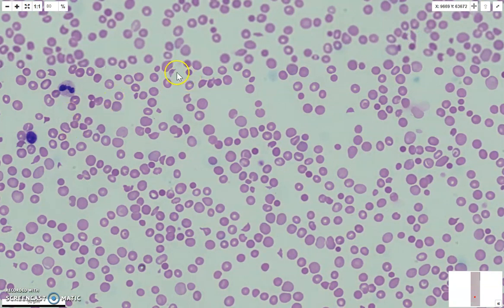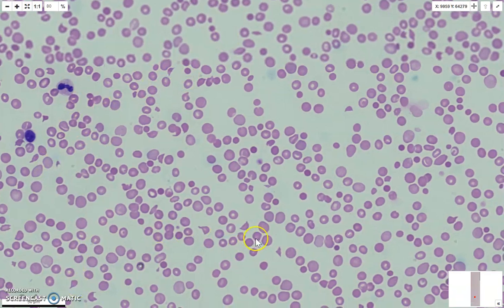Sorry for my resolution on my computer. Hopefully this will work for you, but if you go onto Omero, you will see these for yourselves, and you can play with the brightness as well to get some decent clarity to your cells.